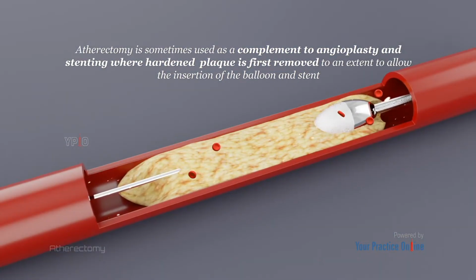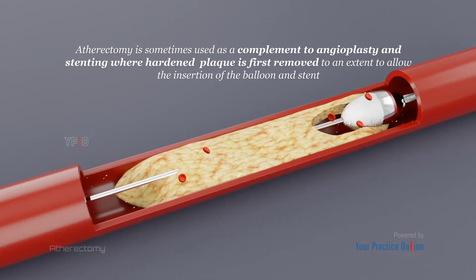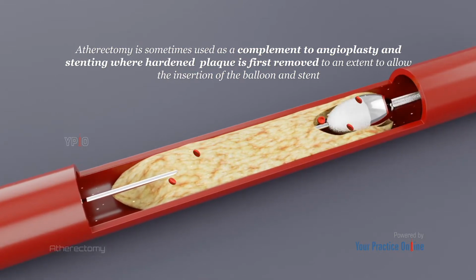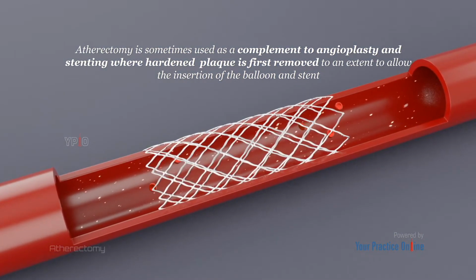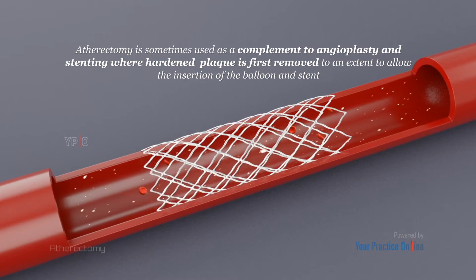Atherectomy is sometimes used as a complement to angioplasty and stenting, where hardened plaque is first removed to an extent to allow the insertion of the balloon and stent, which are then expanded to widen the artery and improve the blood flow.